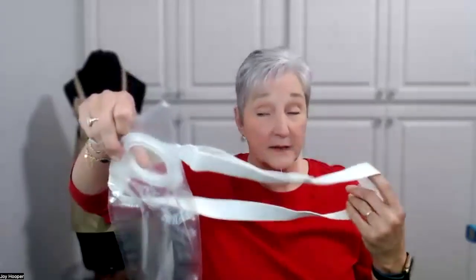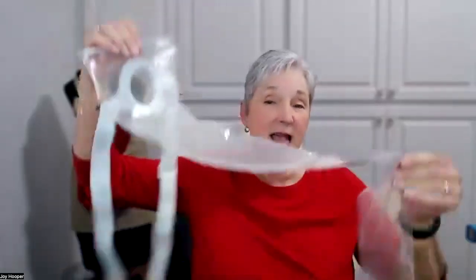This one also has a thumb regulator, and it's got a little wheel that spins around to show you how fast your water's going in. So this is your irrigation bag. And then you'll also wear an irrigation sleeve. It goes around your body with a belt. This is actually a two-piece system with the belt, but they do make it in a one-piece system as well.